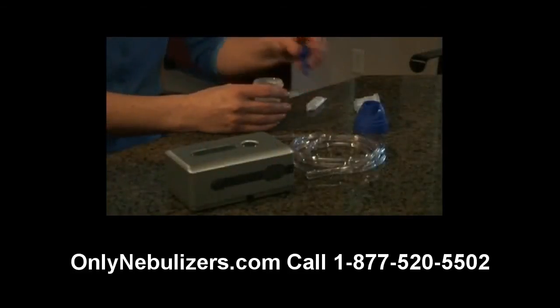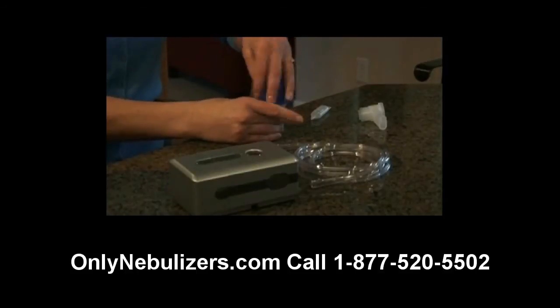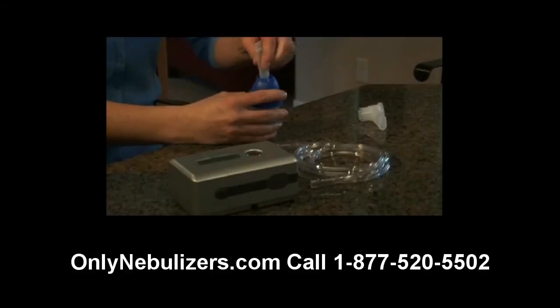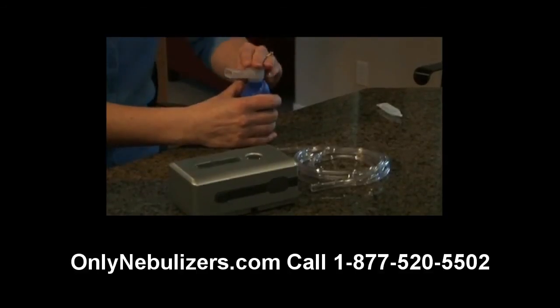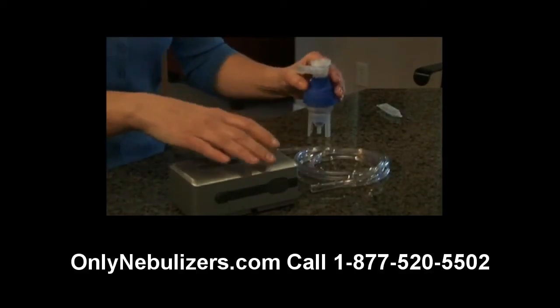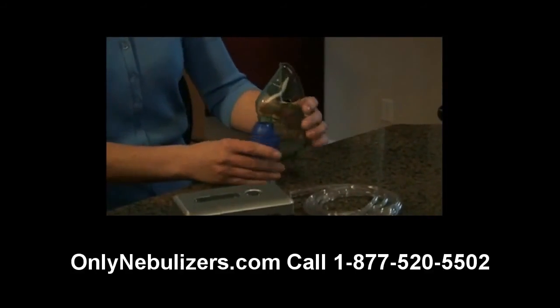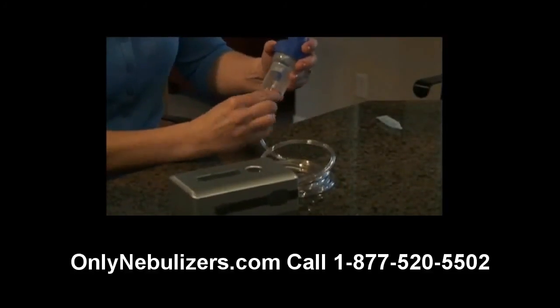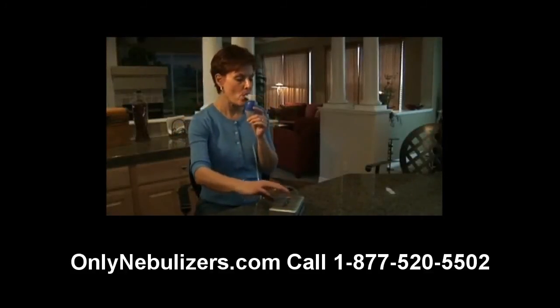After washing your hands, insert the baffle into the nebulizer medication cup. While holding the cup, attach the nebulizer cap by turning clockwise. Next, add the prescribed dosage of medication into the nebulizer through the large opening in the top of the nebulizer cap and attach the mouthpiece to the cap by pushing gently straight down. If you're using an aerosol mask, place the mask adapter directly into the top of the nebulizer cap. Finally, attach the tubing to the nebulizer air inlet connector.